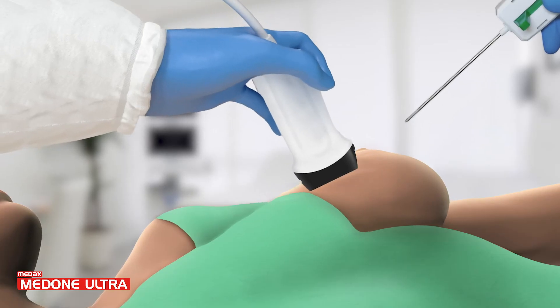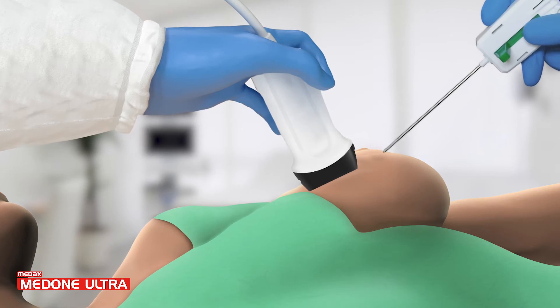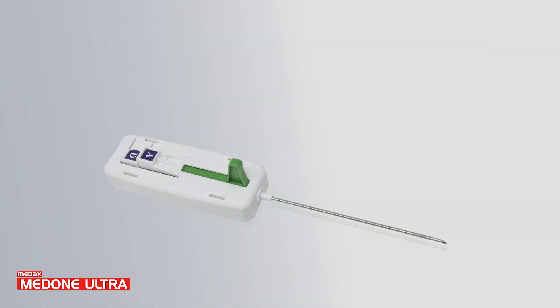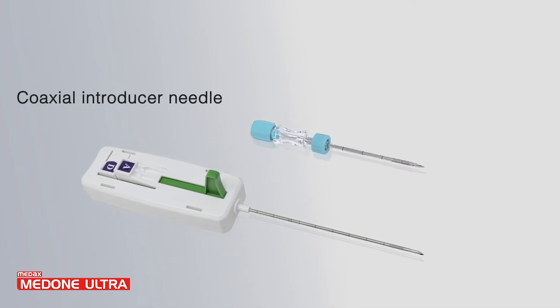MedOneUltra features such as the echogenic tip, light weight, and compact design make it comfortable when used under ultrasound guidance, CT scan, and other major imaging guidance. MedOneUltra can be used with a dedicated coaxial to allow multiple accesses to the biopsy site with a single puncture, causing less trauma to the patient.